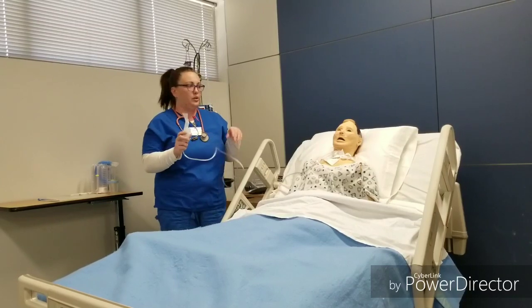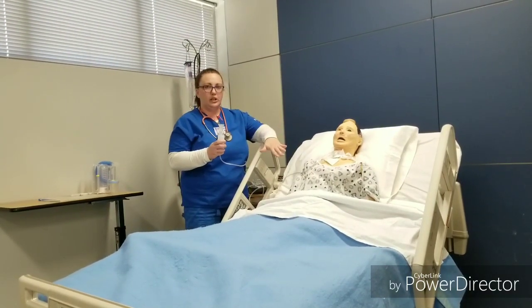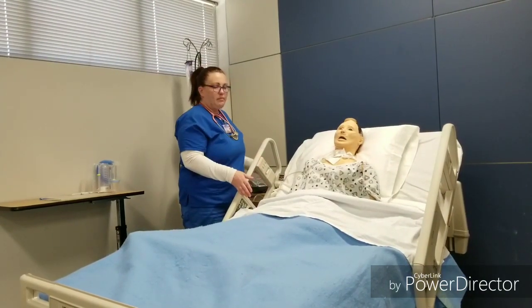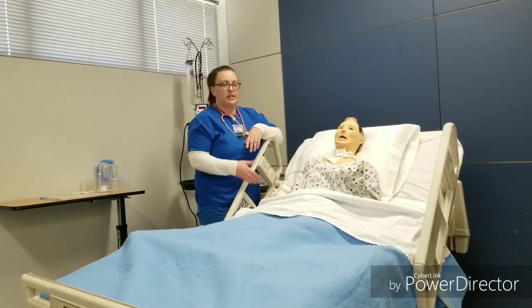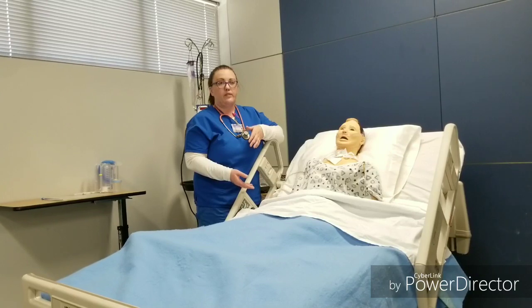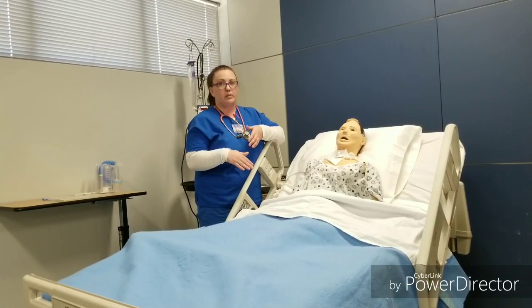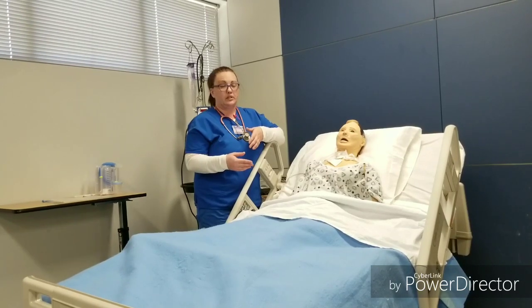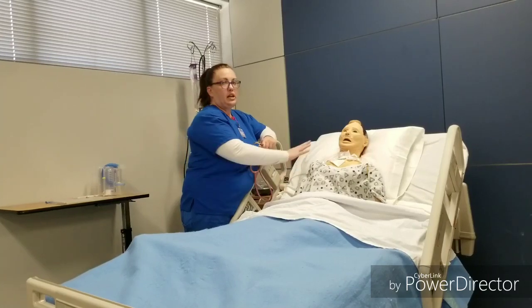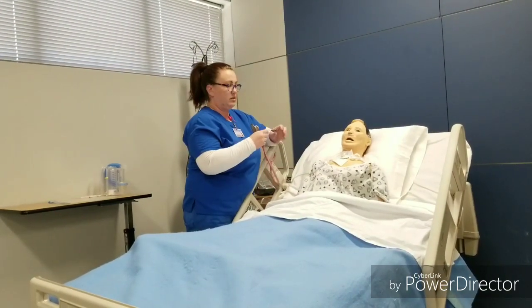Before you would administer this nebulizer, you'd want to listen to your patient's lungs and check your patient's pulse. You need to get a baseline reading on your pulse, because after the treatment is over, you want to reassess the pulse, and if it has raised more than 20 above what your baseline number was, you need to notify the physician. So, normally you would listen underneath the gown to auscultate the lungs, but I'm going to do it over the gown.